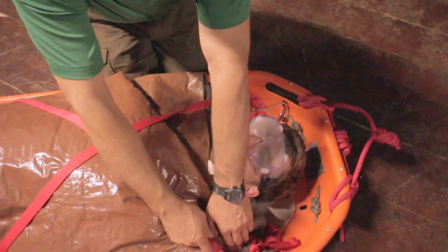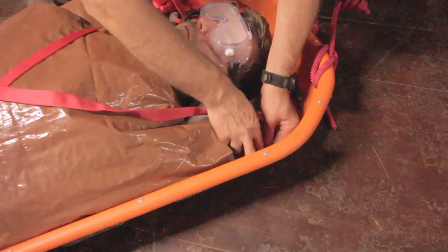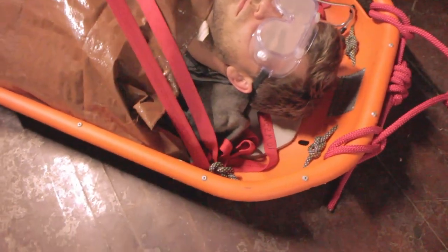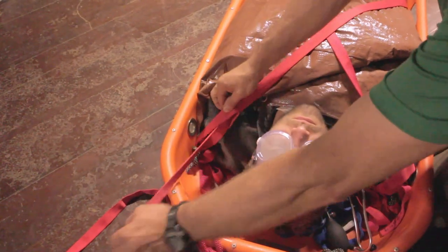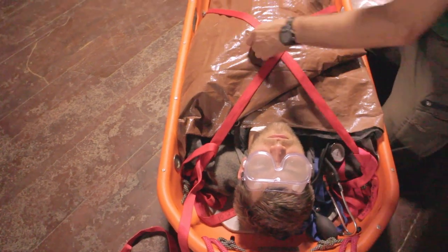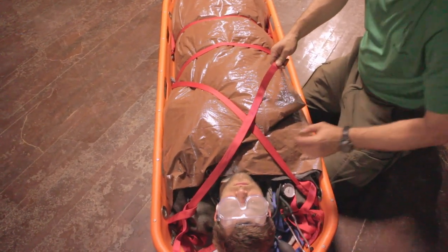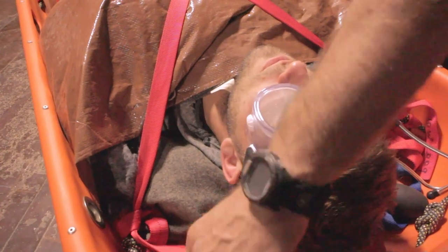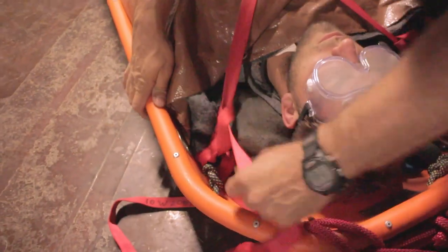For my last one over here, I am going to make this snug and take up the tension. With upper lashing, we want to make sure that we're securing the torso adequately. Whether we make a single X or multiple Xs really depends on the injuries the person has sustained and their body configuration — every patient fits in this a little differently. In this case with Eric's configuration, if I come to these upper side rigging points, I can get a nice X across his upper body that will give me plenty of stabilization. Working carefully around my patient's face with no twists, I'll start a half hitch, then tension this by pulling in each direction to get it started. Eric, can you take in a nice deep breath for me? I'm going to go ahead and tighten there. How is that — can you breathe okay and yet you feel quite snug and secure? Feels comfortable. We're going to go ahead and finish terminating this with our final two half hitches and tuck in the rest.